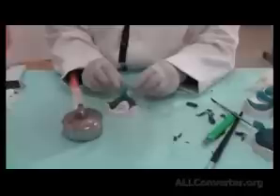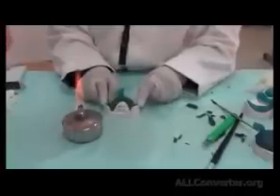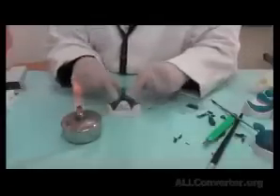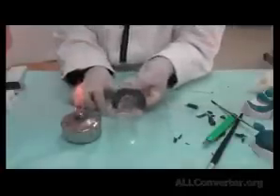And in the patient's mouth, I'm going to give them all instructions at once. Please blow your lips. Go with your lips to the left and right. Open maximally. Go with your mandible to the left and right. Open maximally. Say ick. Swallow. Put your tongue to the left and the right inside your mouth. Protrude the tongue and go backwards with your tongue as much as you can, touching the palate. And that's the lower border molding finished from the patient's mouth.